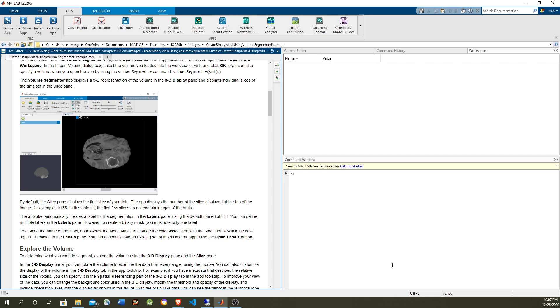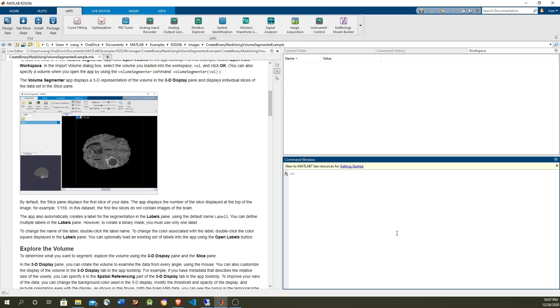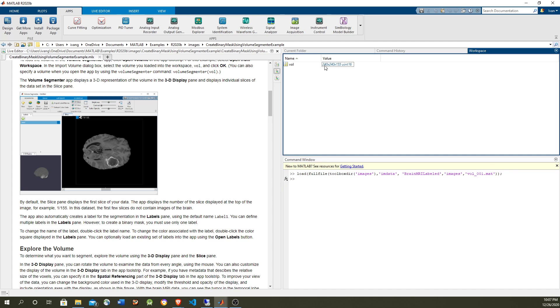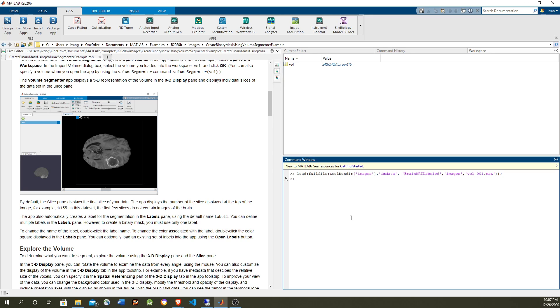So let's start doing this. Let's load first the MRI image of the brain, which is in this mat file that comes with MATLAB. You can see that it is three-dimensional and since it is grayscale then the color is only represented by an unsigned integer 16.